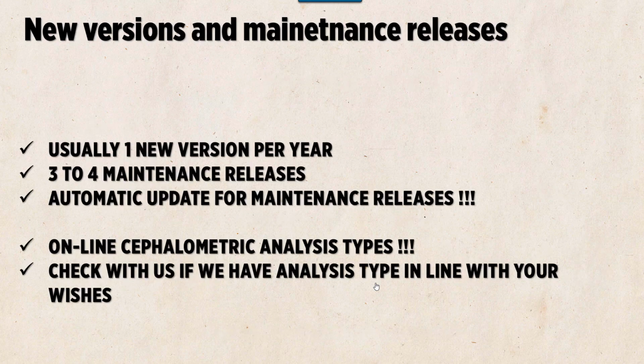We usually release one version per year with several maintenance releases. The update is automatic, but at your consent, so you are given an option to do it or not. Also, cephalometric analysis types can be upgraded and added through online services which we provide.